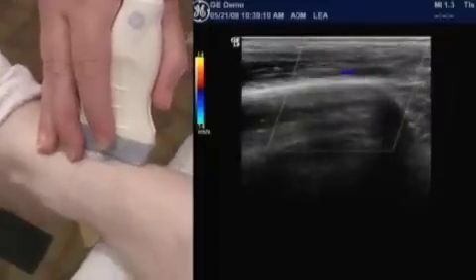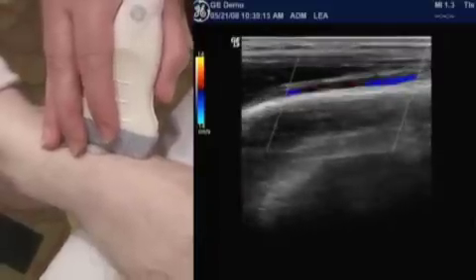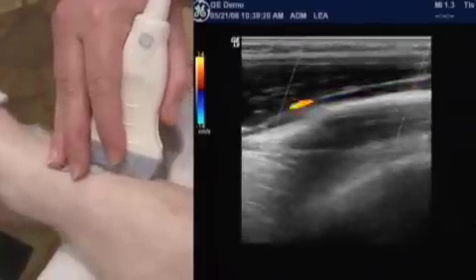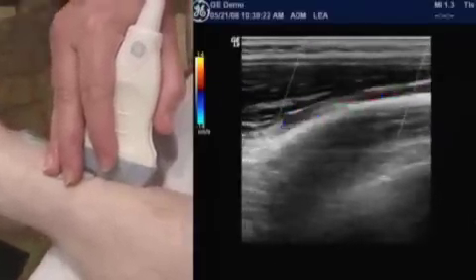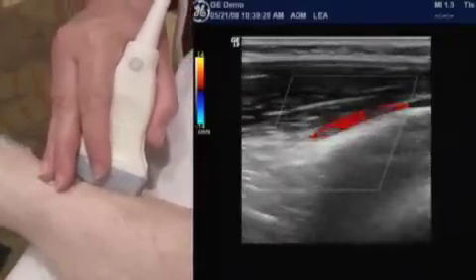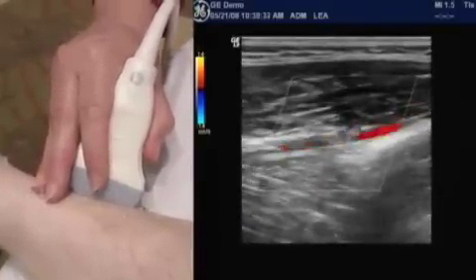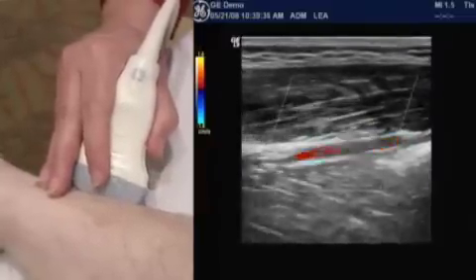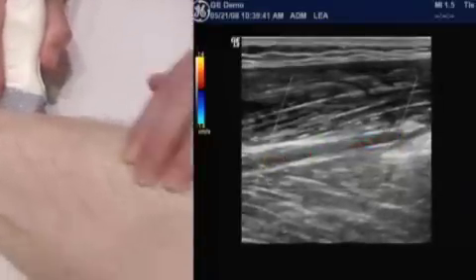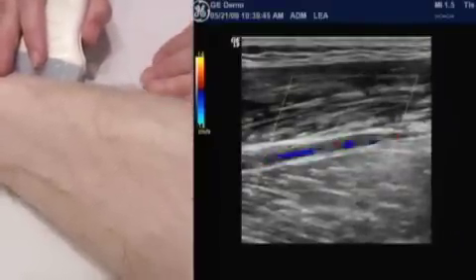It's curving up around some of the ankle bones, and here we see it coming back up. And we can see, even on color, I think you can appreciate this vessel is a little bit smaller than the posterior tib, but we're going to follow it back up. Here we are coming along. And we saw where it took off, up off the popliteal, and now we're going to follow it right along the anterior compartment. And if you can appreciate, his tibia is about here, the top edge of it. So we're just a couple of centimeters over.